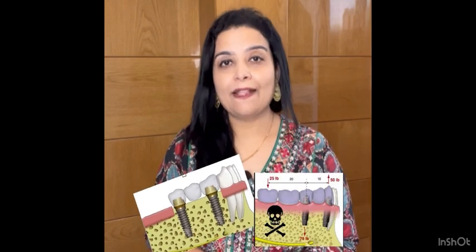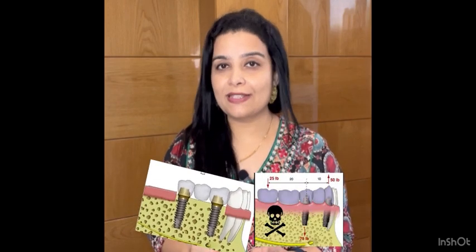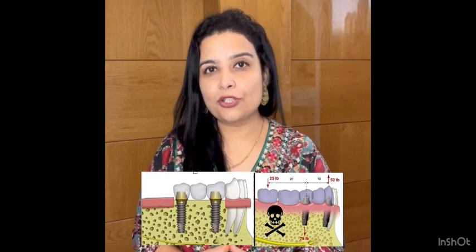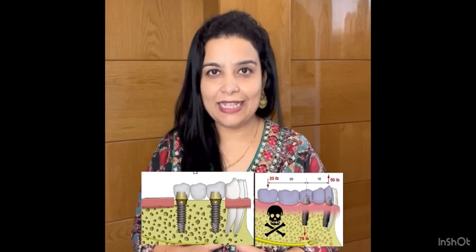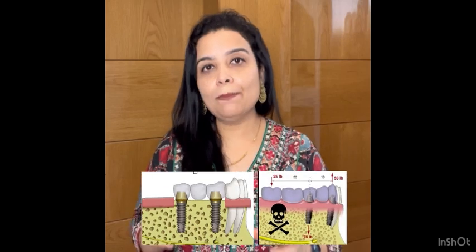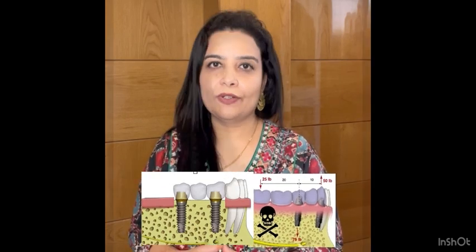Rule number 1. The terminal abutments of the prosthesis are key implant positions. Whenever you are using implants to replace 2 or more clinically missing teeth, then the terminal abutments of the prosthesis should be supported by implants. There should be no cantilevers.